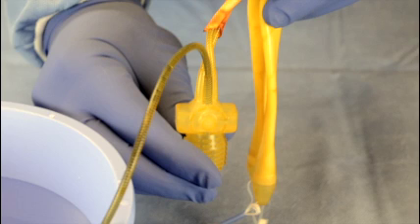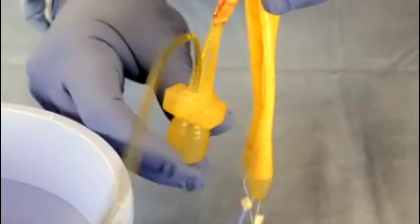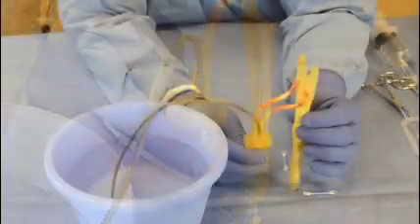Saline should appear in the pump bulb. This step is important to lubricate the valves of the pump for further prepping. If saline does not appear in the pump bulb, or if the bulb does not fully re-inflate, press the deflation button one time and release. This will reset the pump. This sequence may be required more than once to get the pump activated.